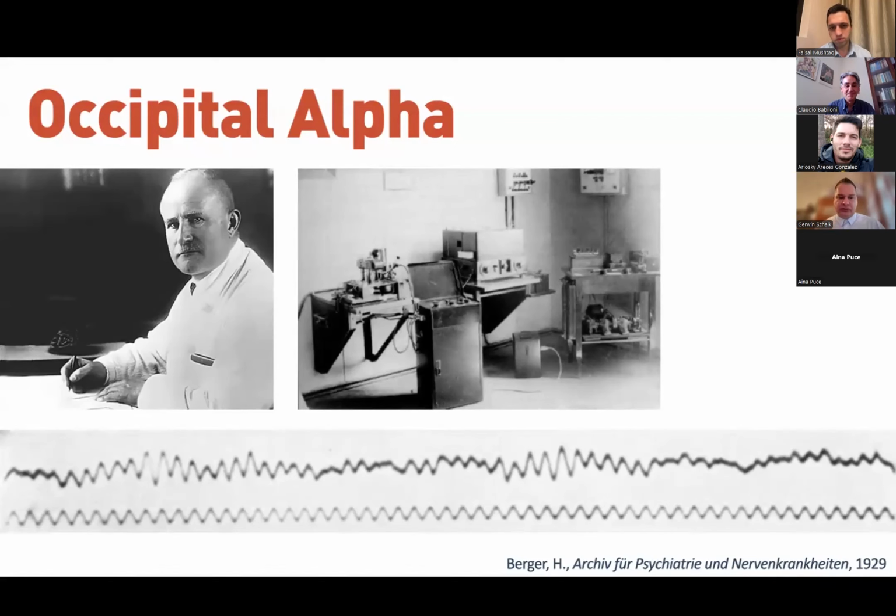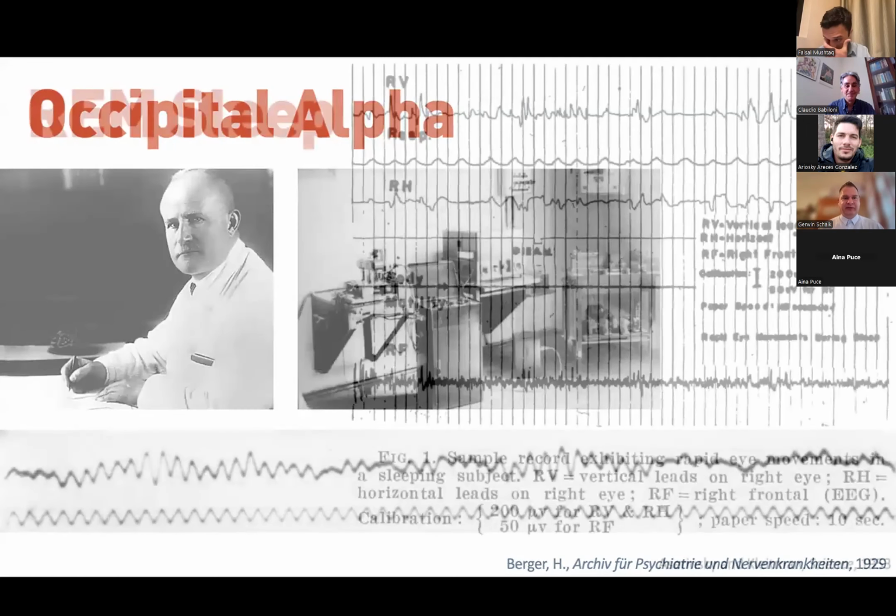What I do want to draw attention to is that these recordings were obviously done by ink and pen and paper at first, before they were being shown on some computer screen. And the clinicians actually started looking at the waveforms and tried to understand what the waveforms tell us. And so, of course, Hans Berger demonstrated the eyes open, eyes closed relationship, as we've just heard about.